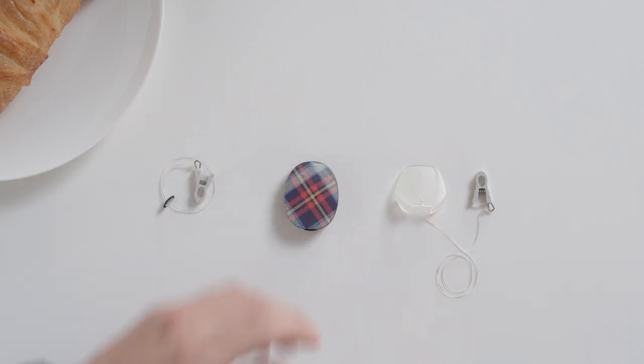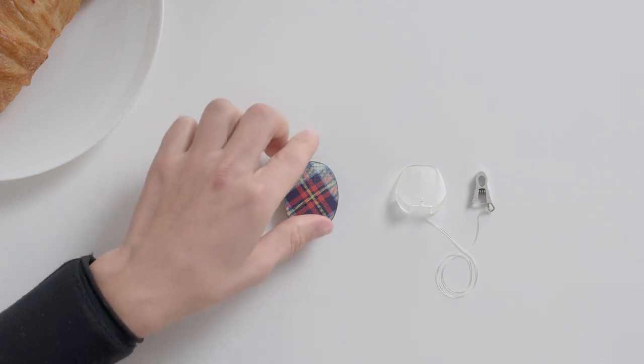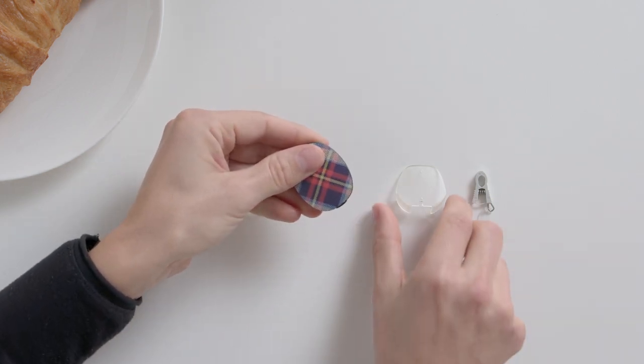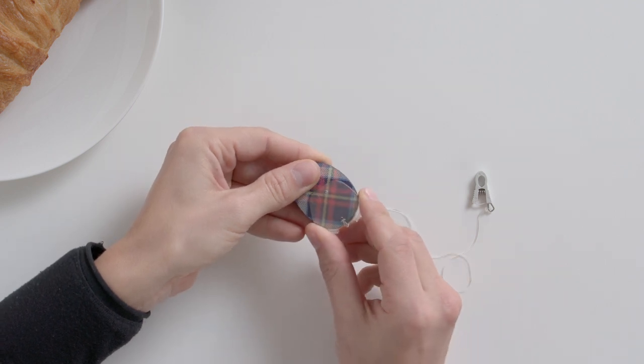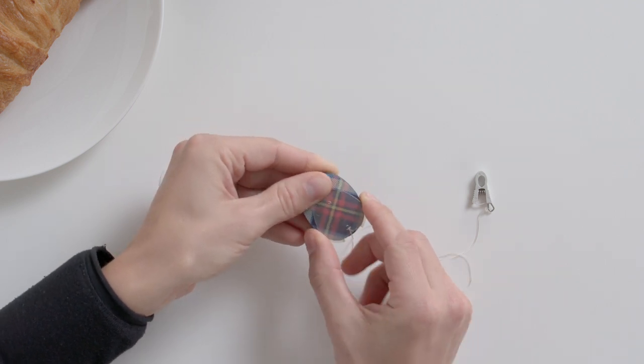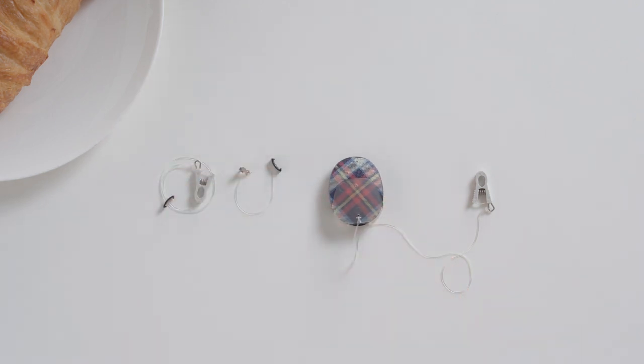To use the clothing attachment clip with cap, hold your RONDO 3 with the microphones facing up in one hand. Hold the cap between the forefinger and thumb in your other hand. Slide the cap onto the audio processor so that one lip and then the other lip are pushed into the grooves furthest away from the rubber socket cover. Make sure that the leash does not get caught under the cap. You can now use the clip to attach RONDO 3 to your clothing.